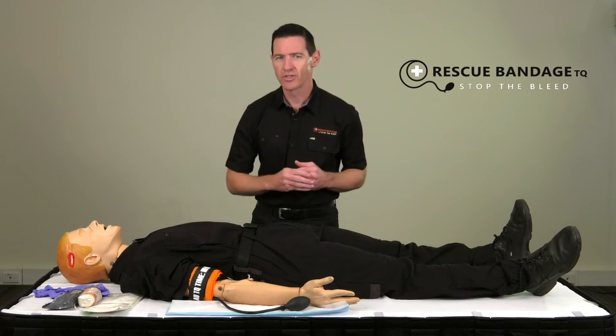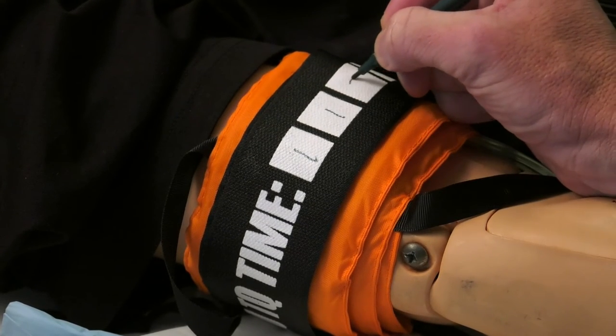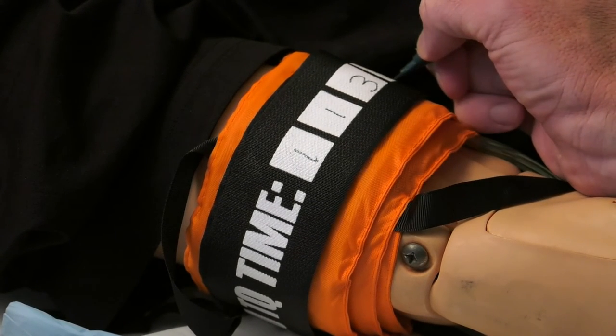One final but very important step is to identify the time that the rescue bandage was applied. This can be easily marked on the outside of the bandage.